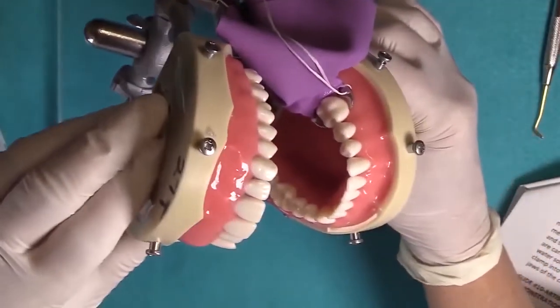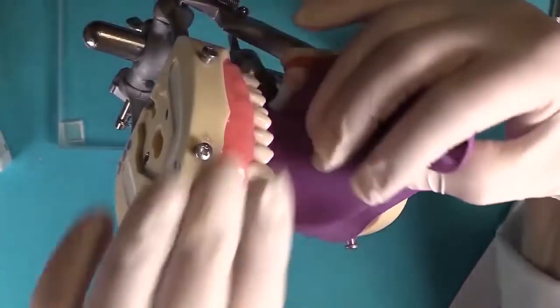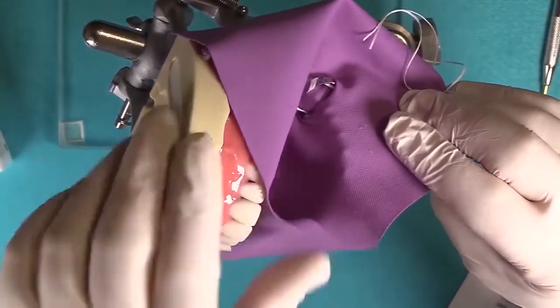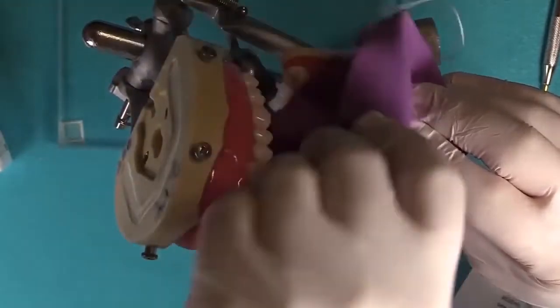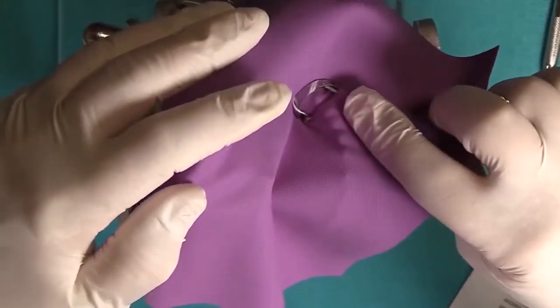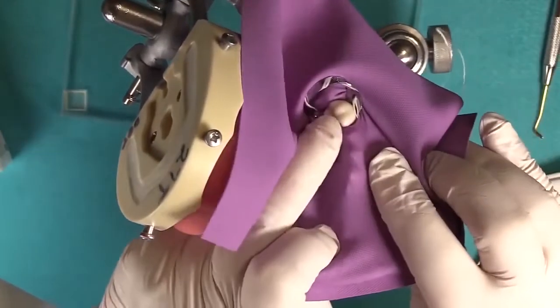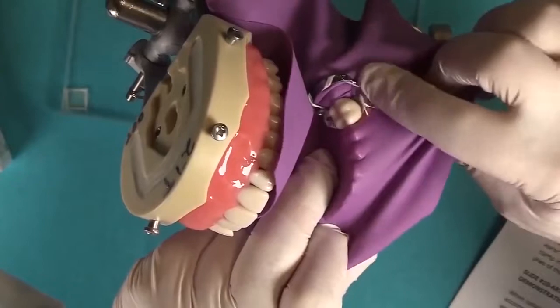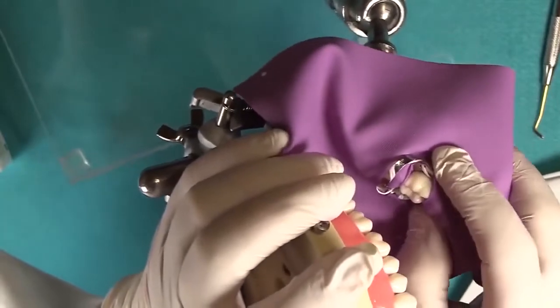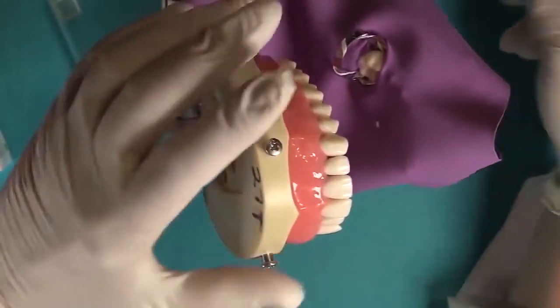Now at this point, I am going to open the dental dam. We're not quite ready for the frame yet because the cheeks will keep it forward like this. But can you see now we've got the bow exposed? Here, it'll look something like this in the mouth. We have to expose the remaining part of the clamp and the tooth. With your index finger on top and thumbs underneath, you want to pull up and over until the entire clamp and the tooth are exposed. Okay, so now we've got everything exposed and the dam is secure around the jaws of the clamp. Now we're ready for our frame.